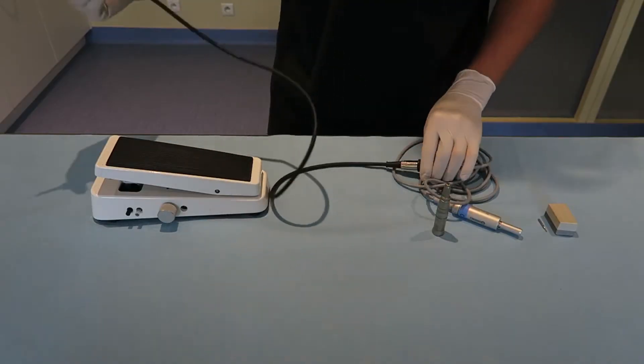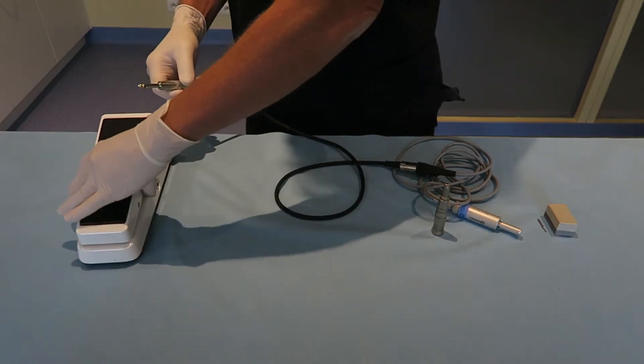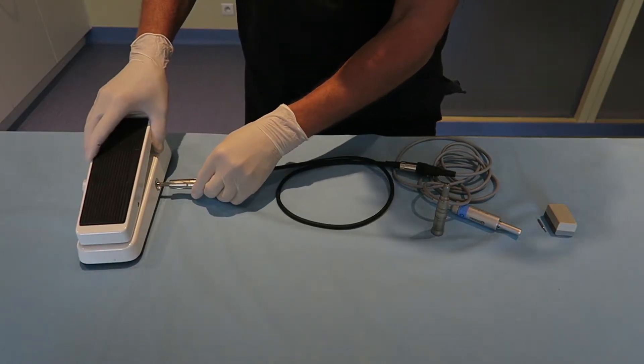The other end of the liaison cord must be plugged into the side of the pedal. Do not hesitate to apply pressure to connect it.